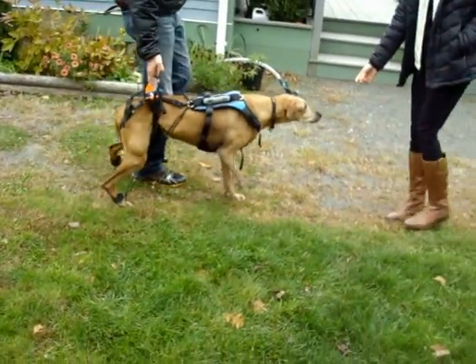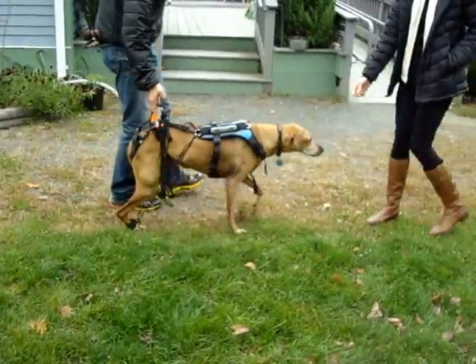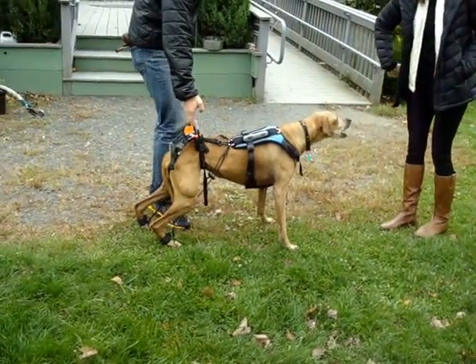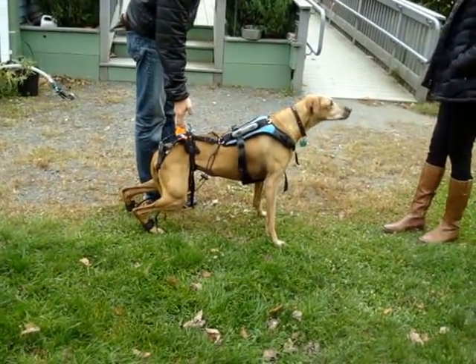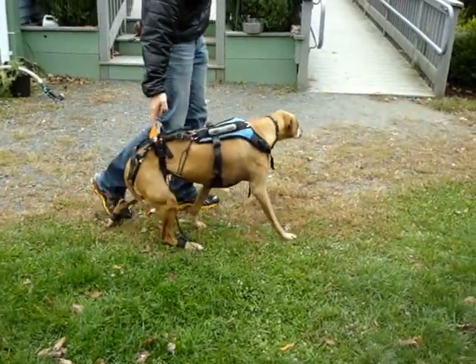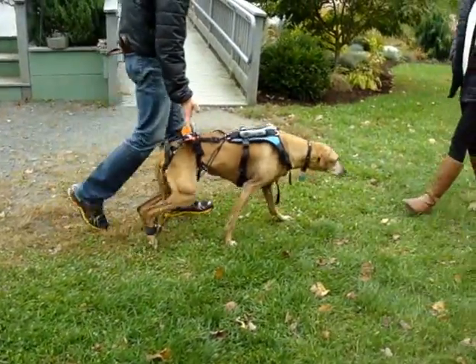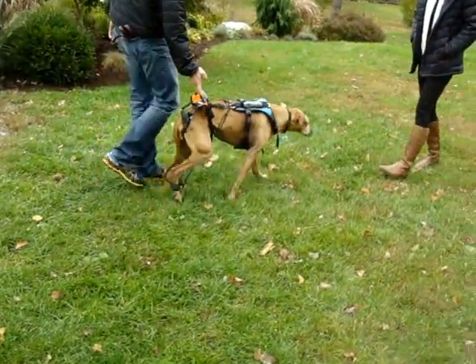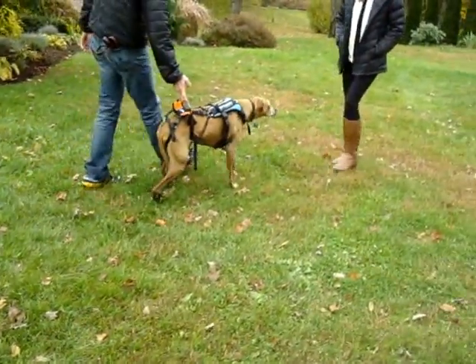Here we have applied the new resistance bungee system, helping her to re-correct her positioning through her reflexes. This is a year and a half long diagnosis and progress with degenerative myelopathy. She's reaching that stage of chronically knuckling, even when swimming.